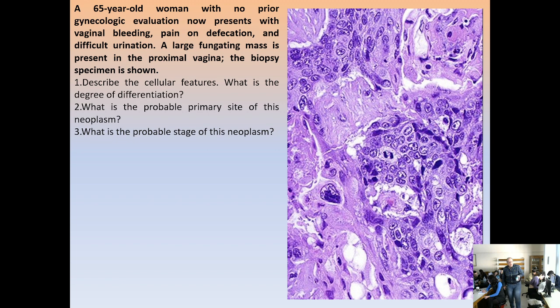In the cells that have an adequate amount of cytoplasm, what color is it? Leave the nuclei now, we look at the cytoplasm. What color is the cytoplasm in these cells? Pink. Can you remember cells which have enough cytoplasm and look pink? In which epithelial tissue are these cells a component? For example, in a glandular epithelium, cells do not appear pink because they probably secrete mucin, so they have droplets of mucin. It's not likely to be a glandular tissue.